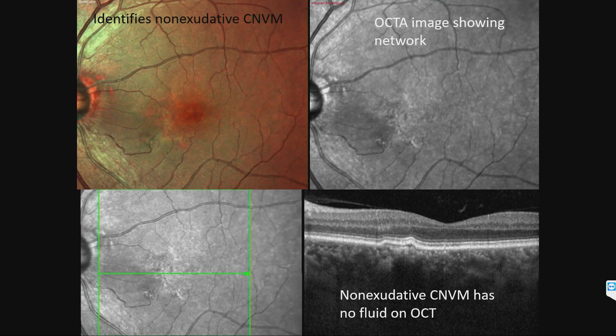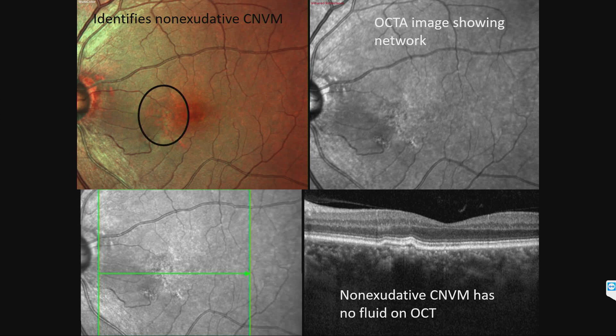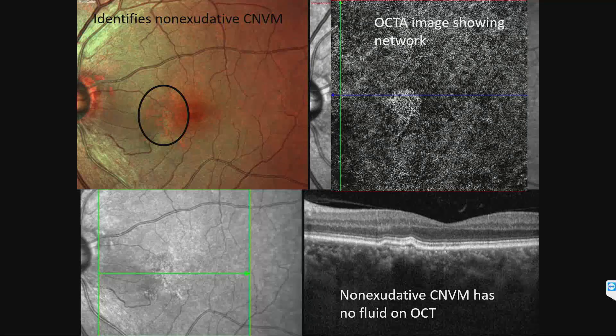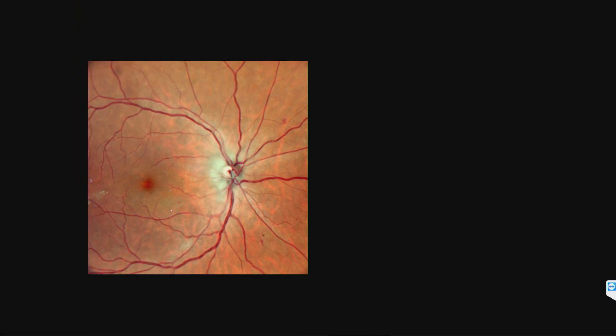Multicolor imaging shows an area of non-exudative CNVM which the OCT angio really picks up, so you might get some clues by looking at the multicolor imaging regarding the presence of a non-exudative CNVM as well.